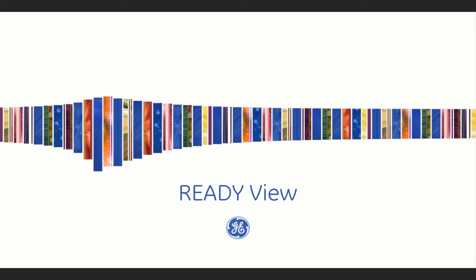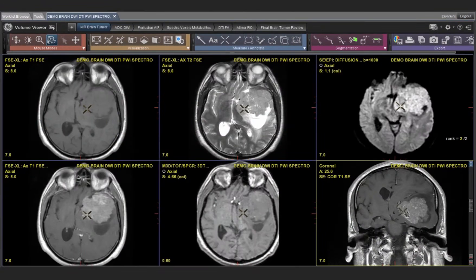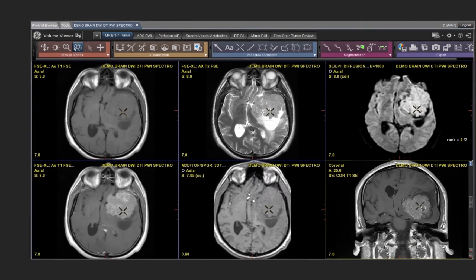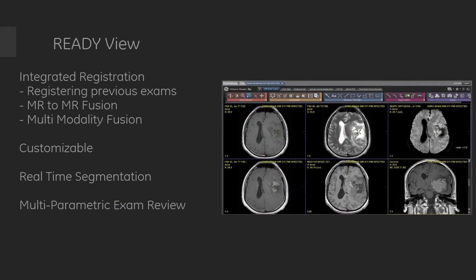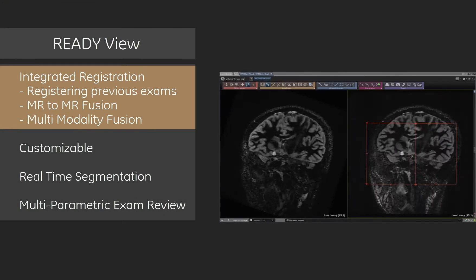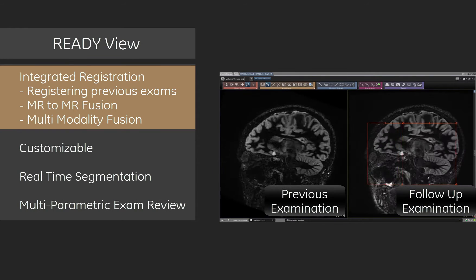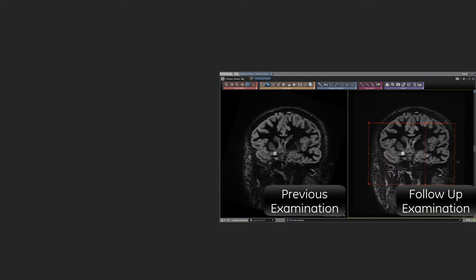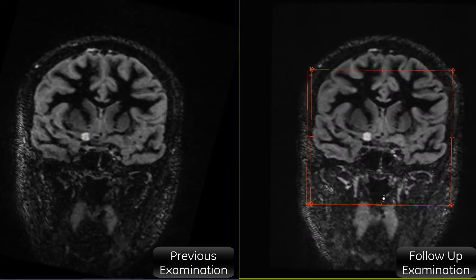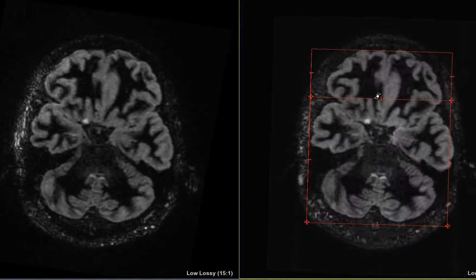ReadyView features tools that allow you to quickly analyze data and help improve accuracy and efficiency. Tools like integrated registration allows alignment of previous studies compared to current examinations to aid physicians in diagnosis and therapy planning.